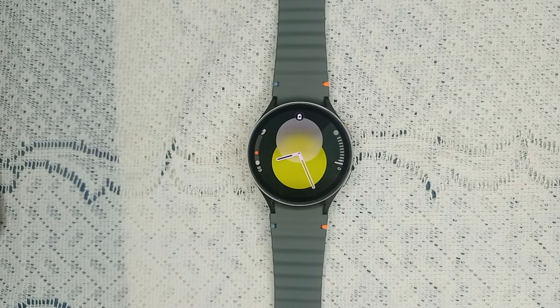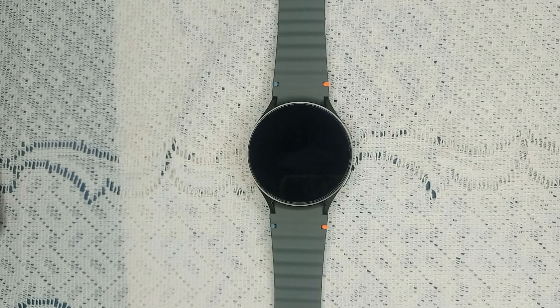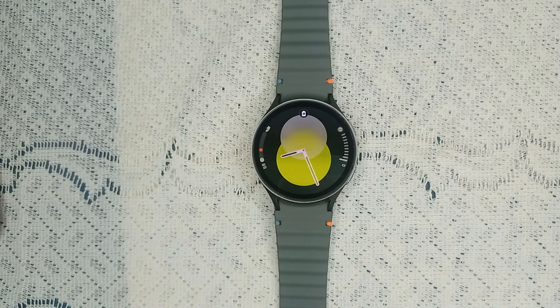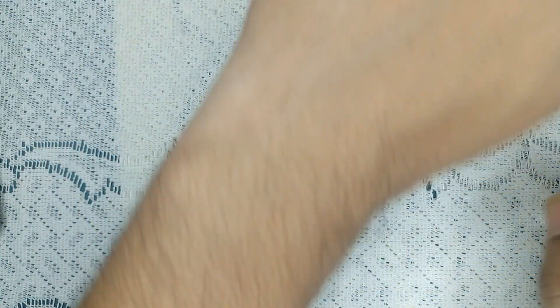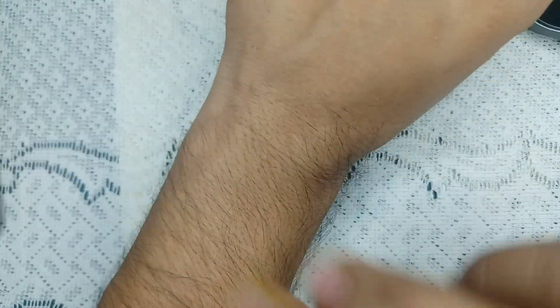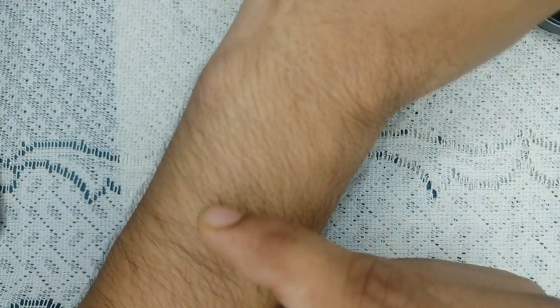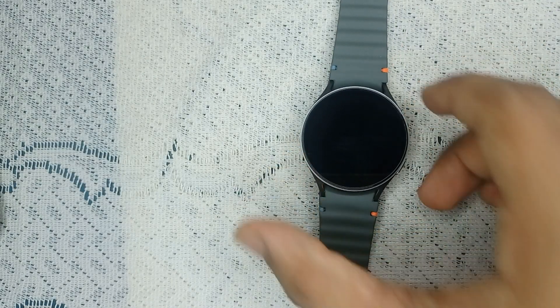If your blood pressure readings are still not working, you can try another fix: check wrist position. Ensure your watch is worn on the same wrist during calibration and measurement. The strap should be snug but not too tight. You can place three fingers on your wrist and then wear the watch just above that point, because the watch takes correct readings from that position.